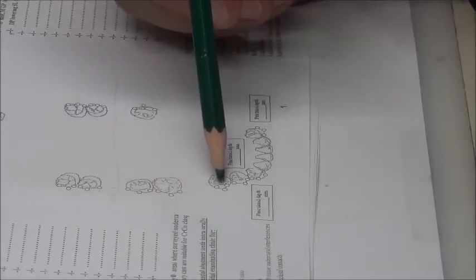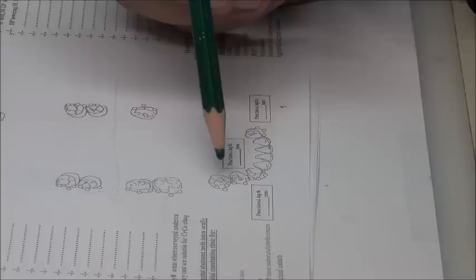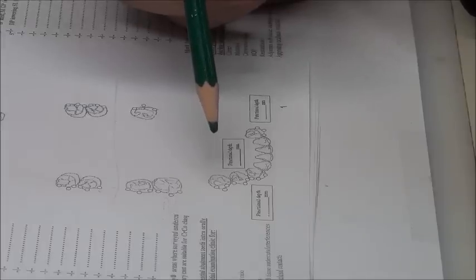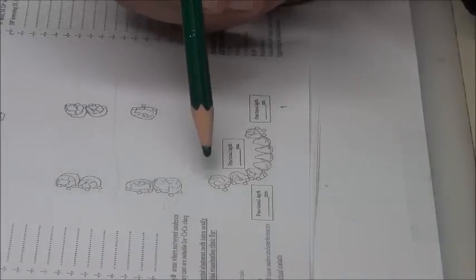It's now not for aesthetics, it's now for support reasons. This is a different case. This has one tooth missing. Yeah, one tooth missing. What do I change? Do I need to change the clasps? No, I don't need to. What do I change? The mesh. I could place a mesh.